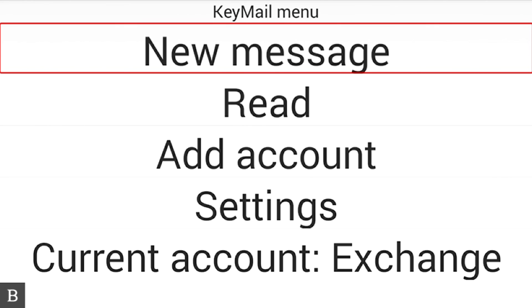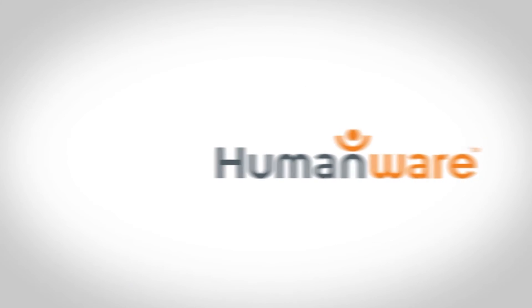By default, the file browser went to the last folder it was in. If it hadn't, I could have pressed Space+D — the command to go to drive selection — if the file was on an SD card or thumb drive. I hope this helps get you started with sending and attaching files to emails. We look forward to speaking with you soon on a future BrailleNote Touch Snapshot video. Thanks a lot.